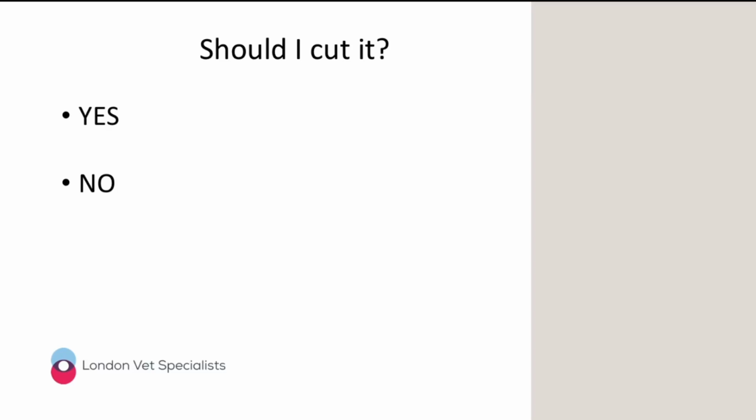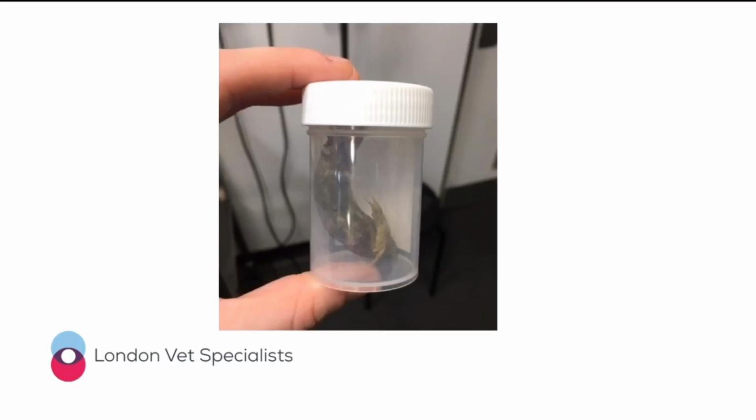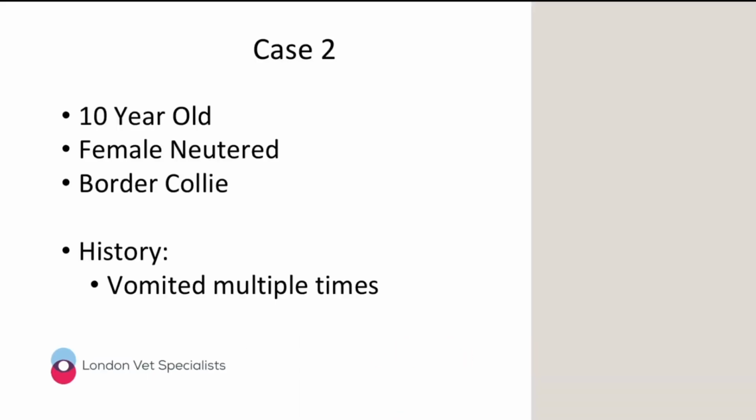And if you decided to get theatre ready because we are going to need to cut this cat, then you'd be absolutely right, because this cat had a hairball or a trichobezoar that was causing a mechanical ileus. So the trichobezoar presented like a typical small intestinal foreign body, so a bright interface, strong associated shadowing, very dilated bowel orad, empty bowel aborad, so two populations of small bowel. And this cat absolutely was obstructed and absolutely needed an exploratory laparotomy and this trichobezoar removing.